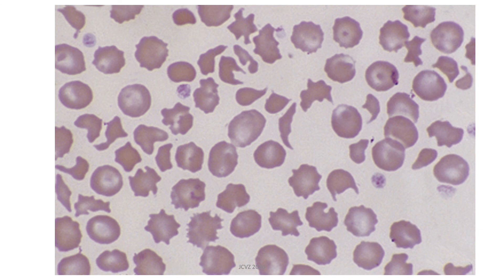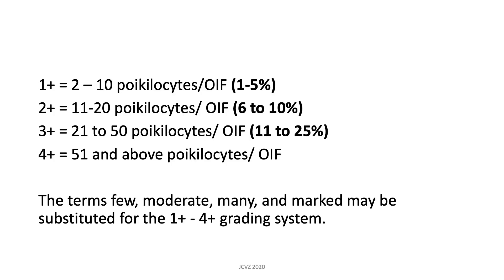Here is an example of a blood smear with many poikilocytes, or many abnormal red blood cells. The grading used for poikilocytosis is as follows: 1+ if there are 2 to 10 poikilocytes per oil immersion field, 2+ for 11 to 20, 3+ for 21 to 50, and 4+ for 51 or more. You can also see the relative percentage of poikilocytes to the number of red blood cells beside each grading. Terms such as few, moderate, many, and marked may be substituted for the 1+ to 4+ grading system in some hospitals.